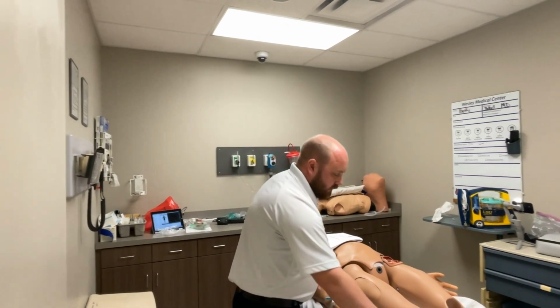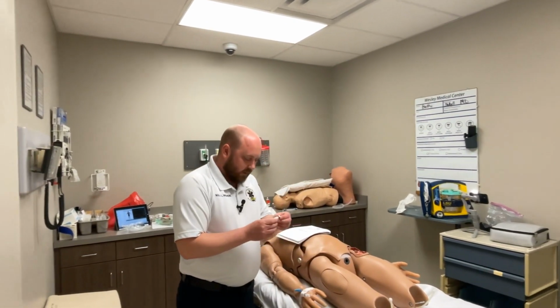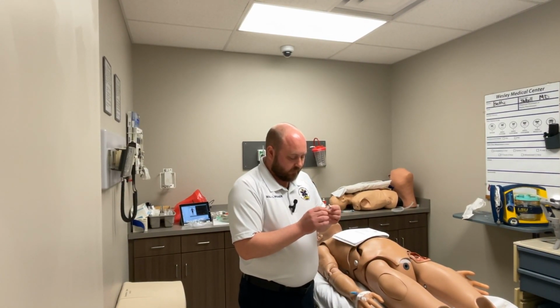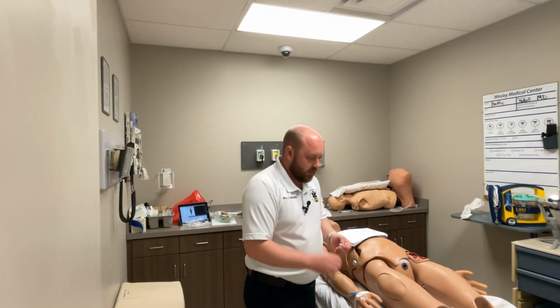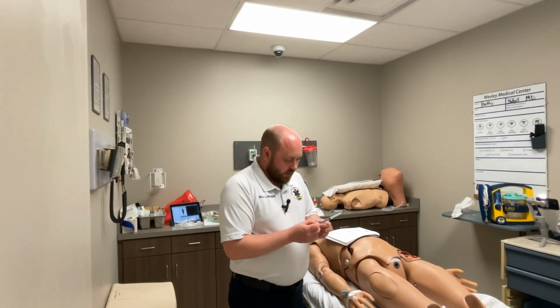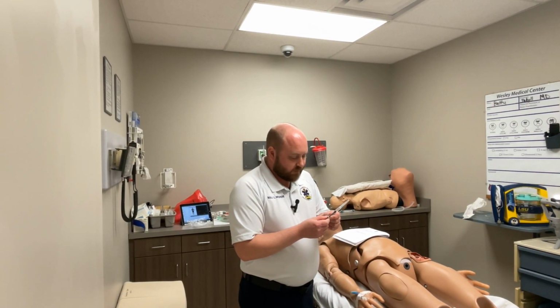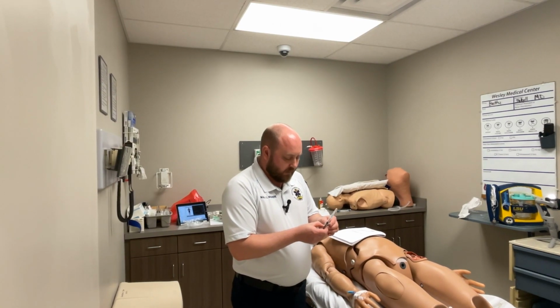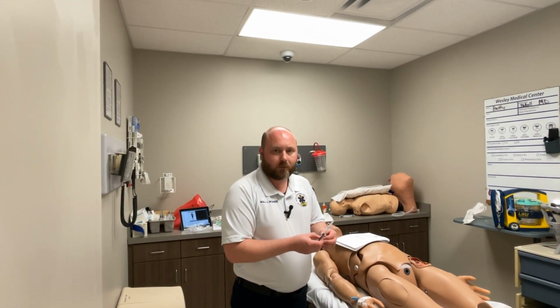So we're going to start with grabbing our fentanyl vial. We're going to make sure that we have good clarity in it and the expiration is okay. Go ahead and grab your needle and syringe, pop it on there, pop it back to 1.5. If it's 100 mics in 2 mLs, that's 50 mics in 1 mL. So 75 is going to be 1.5 mLs.